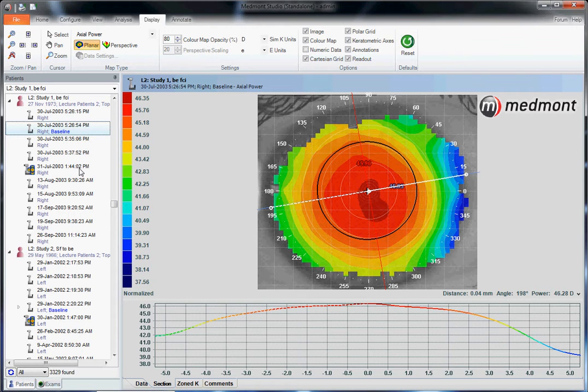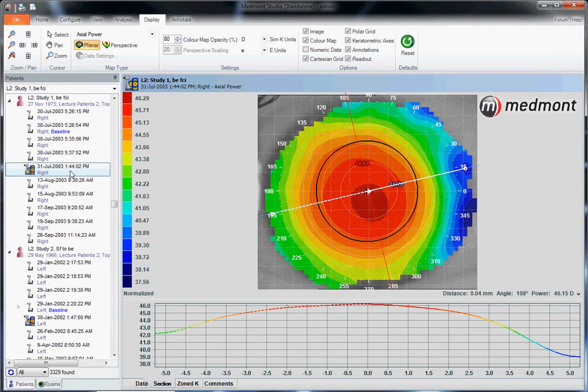However, with the Medmont composite map function, this is the best way to create a pre-orthokeratology baseline map. By having the patient imaged in different fixations, we're able to push the placido across virtually 100% of the visible iris, giving us a larger view of the eye shape for an optimal pre-ortho-K topography.